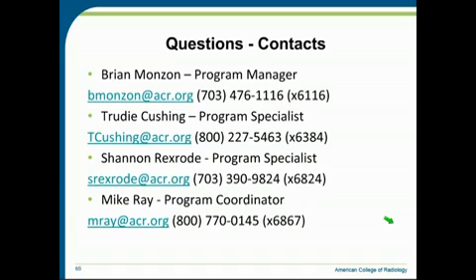So my prescriptions are comprehensive and complete, and you can look at the guidelines and standards from the ACR as to what makes a complete prescription. So it should be treatment site, orientation, energy, prescription, isodose line or depth or whatever. But I encourage you to look at the ACR guidelines, which are pretty clear for what a prescription is.